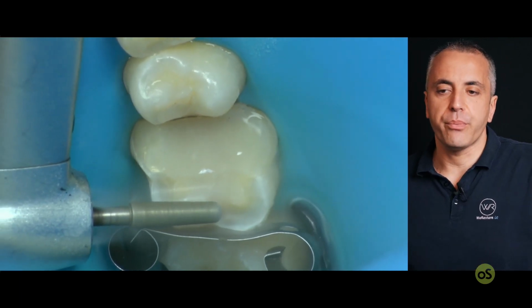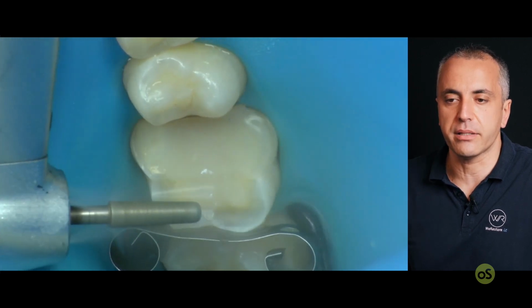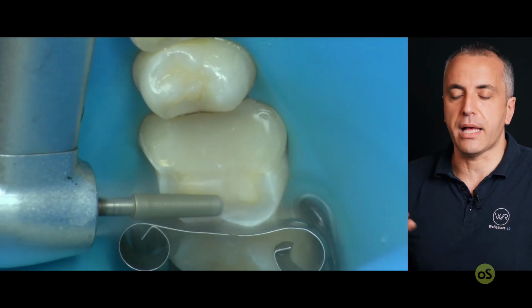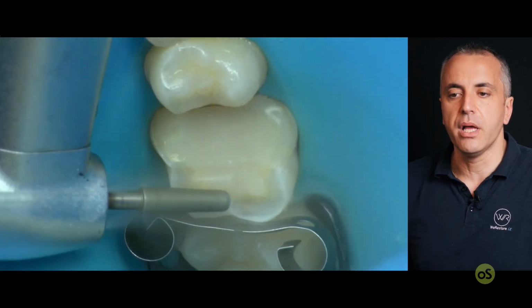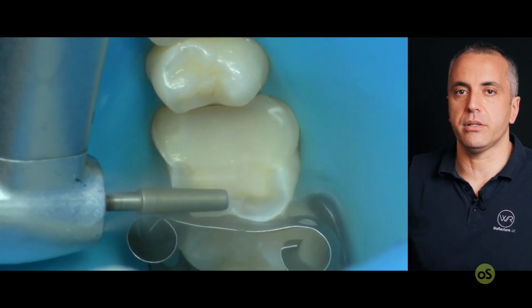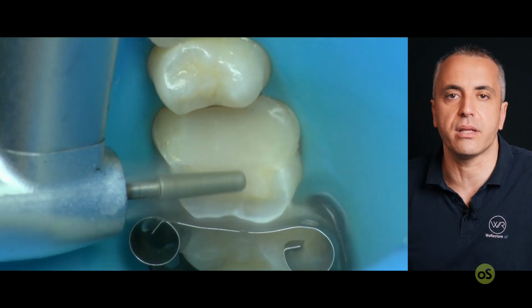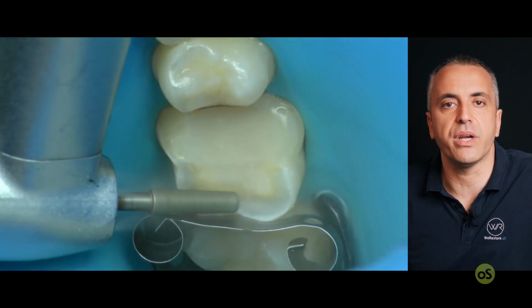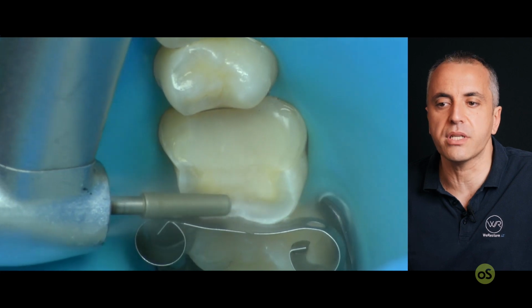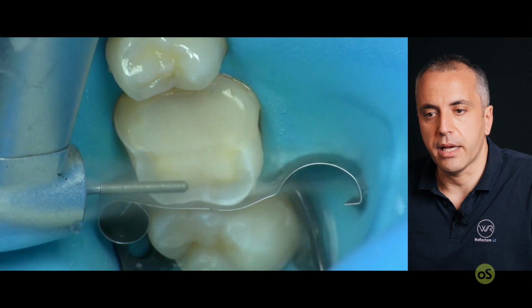So after the initial preparation, a hint especially for beginners is to put all the burr or part of the burr, according to the size of the diameter, making some notches, some depressions, and then connect them. This is nothing new, this is a quite old trick from the prosthetic world, but it's quite easy in order to provide the correct thickness. The protection is quite important because we don't want to harm or damage the other tooth.